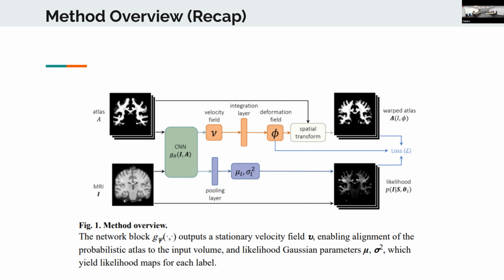But in the caption, it says they view likelihood maps, which to me reads like they build the distribution for that image and those labels. Sure. And then they sample a probability vector from that distribution, and that probability vector is your likelihood for that voxel for every label. Okay, so how do you sample that? TensorFlow normal sample, I don't know.